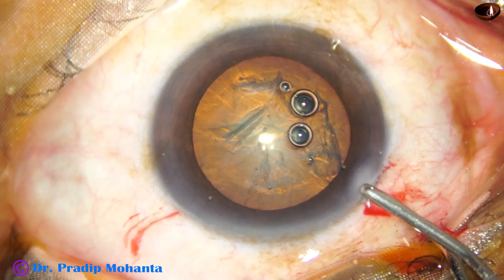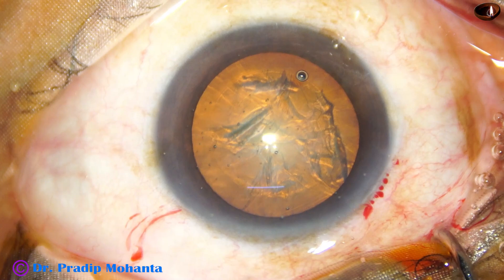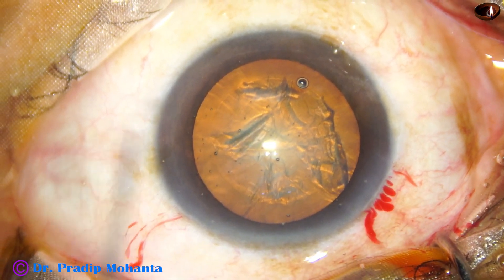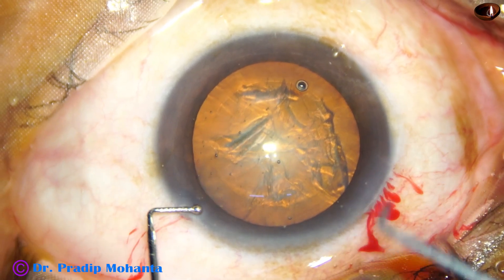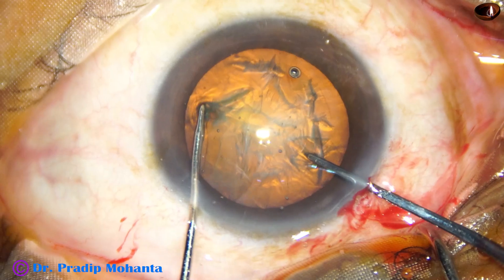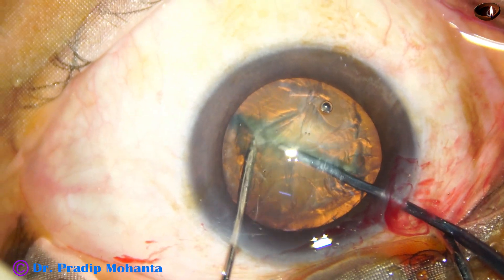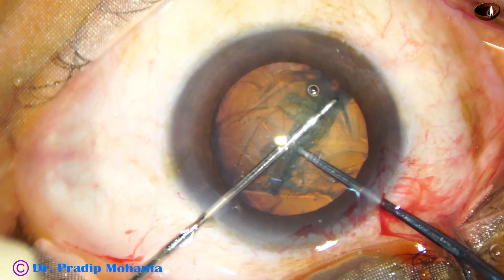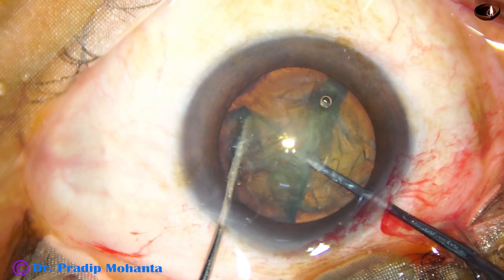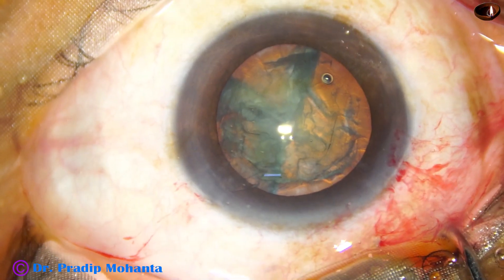The anterior chamber is again filled up with visco. And now we are going to divide the nucleus by a pre-chopper and Neto chopper. This Neto chopper is being used as a nucleus sustainer to support the nucleus. It is a long chopper, about 2.25 mm long.